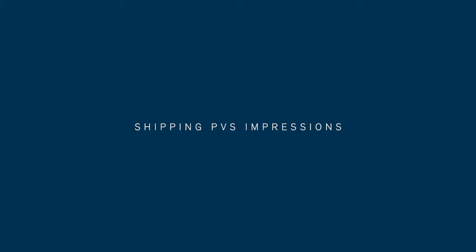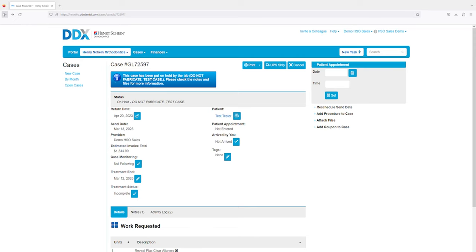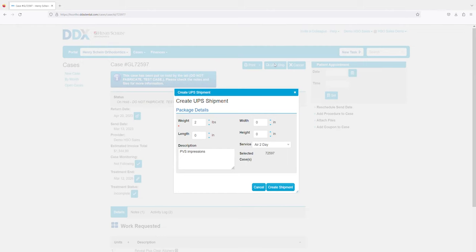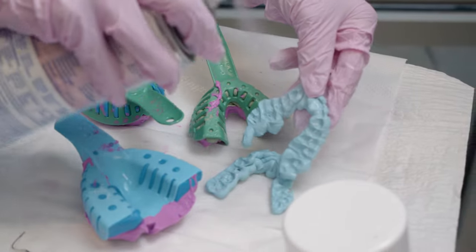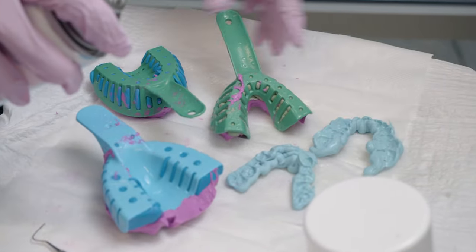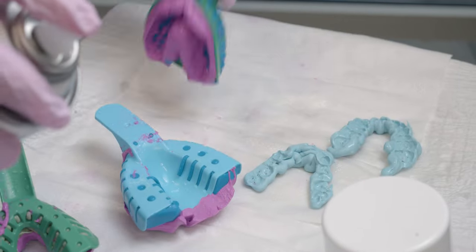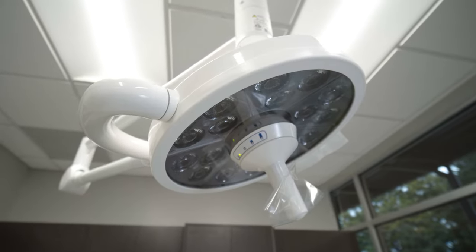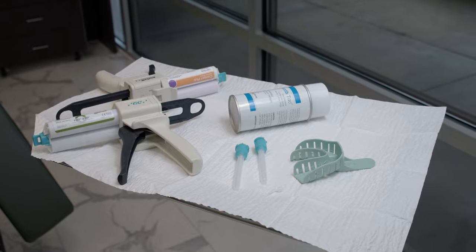To ship your PVS impressions to our Henry Schein Orthodontics Lab, you will need a box, the UPS shipping label, and packing slip that can be found and printed in your patient's DDX account. You'll need to disinfect the upper and lower impression and your bite registration. The impressions and bite registration need to be packaged in a way that will ensure their integrity during the shipping process. Keeping these tips and tricks in mind will help ensure your impressions are accepted by our lab and will provide the quickest and most efficient turnaround for your aligners.